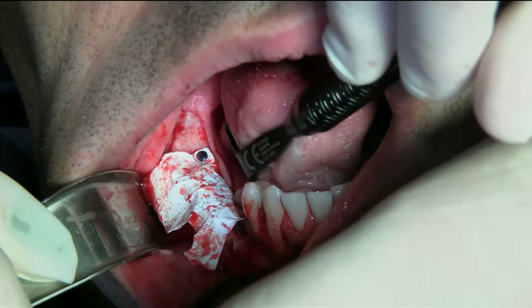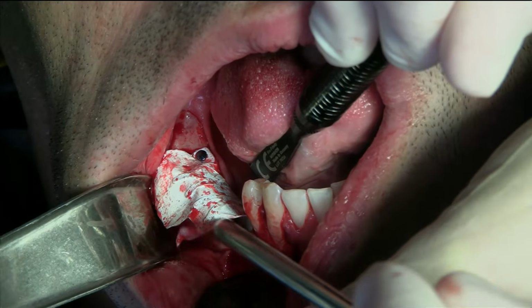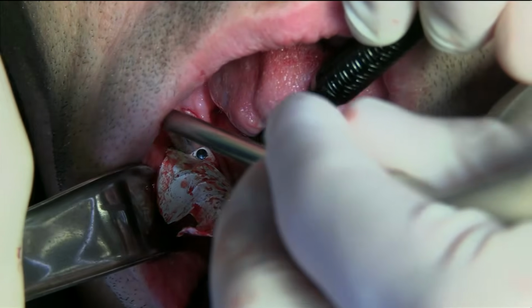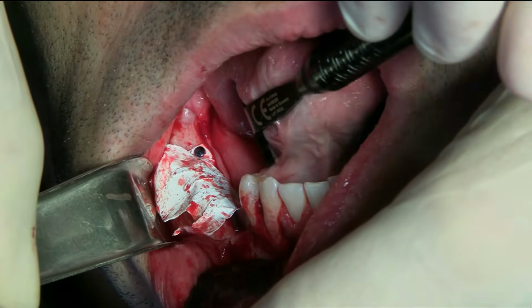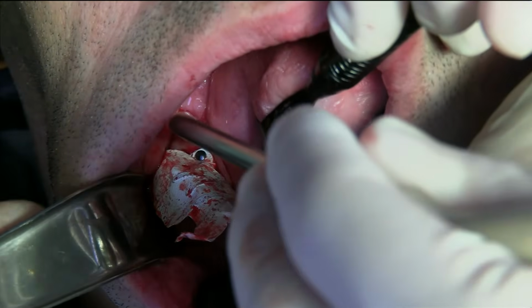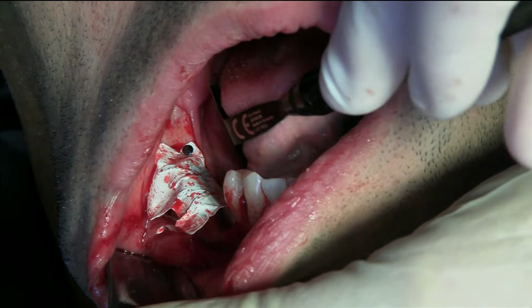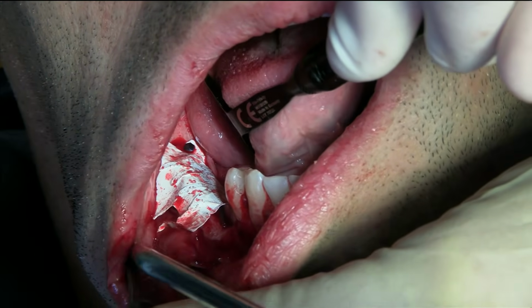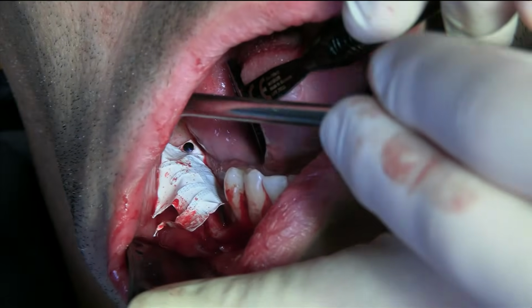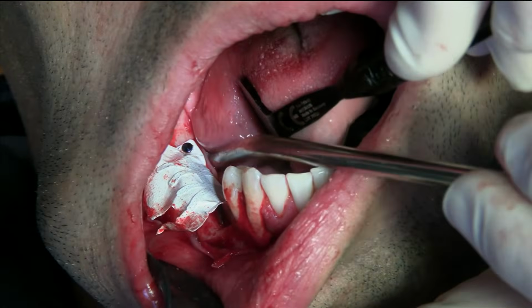So now I need a screw on the handpiece. So we're going to have to get the membrane into the lingual of the premolar. Oops. The short one, the short screw. Okay, now let's hold this one.